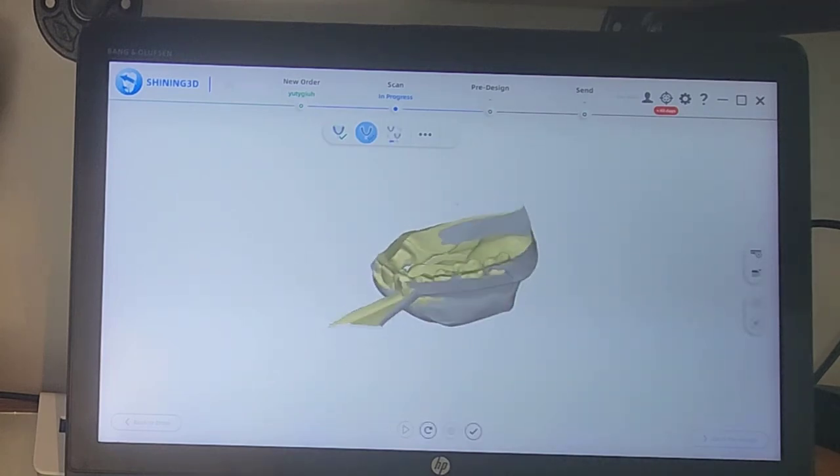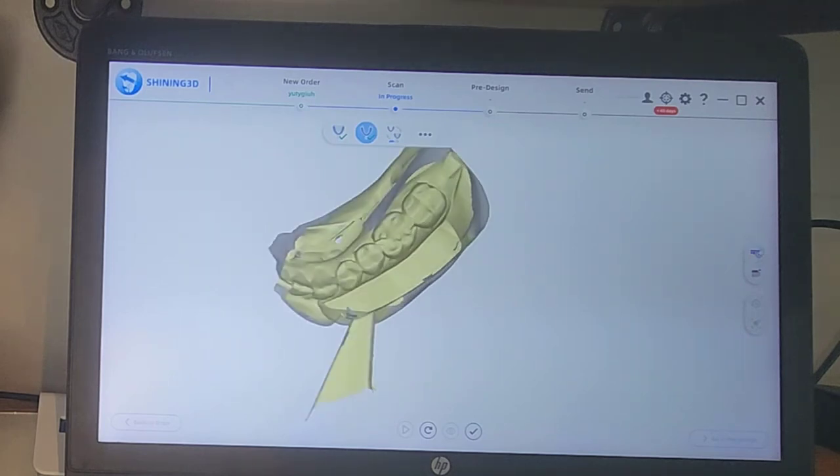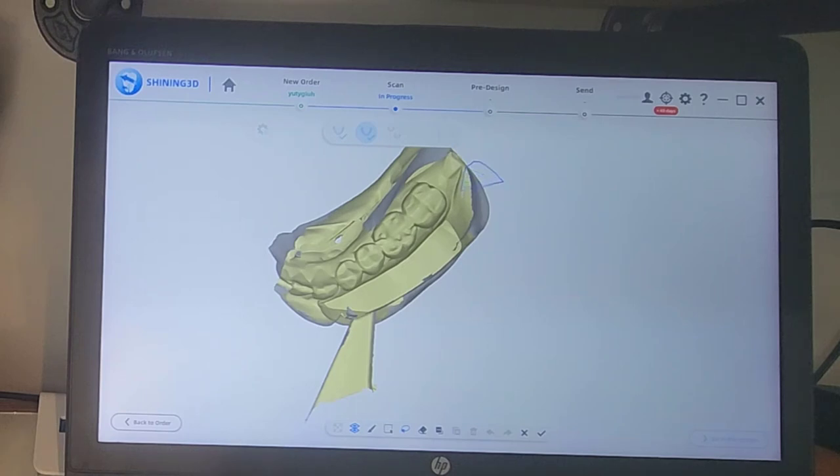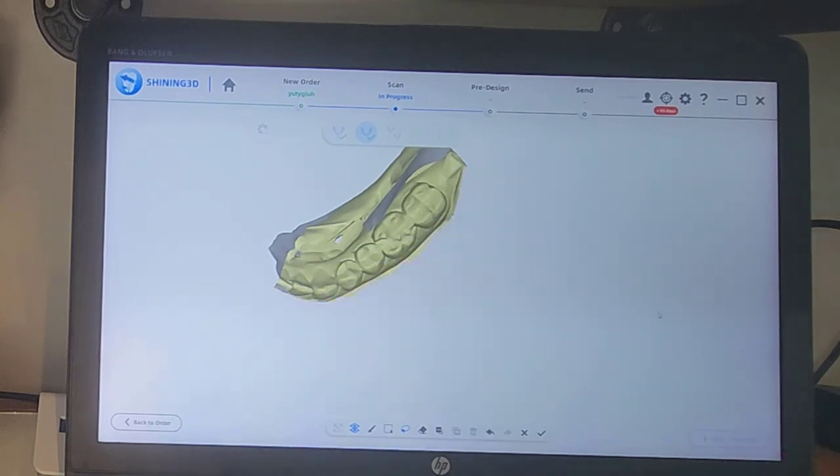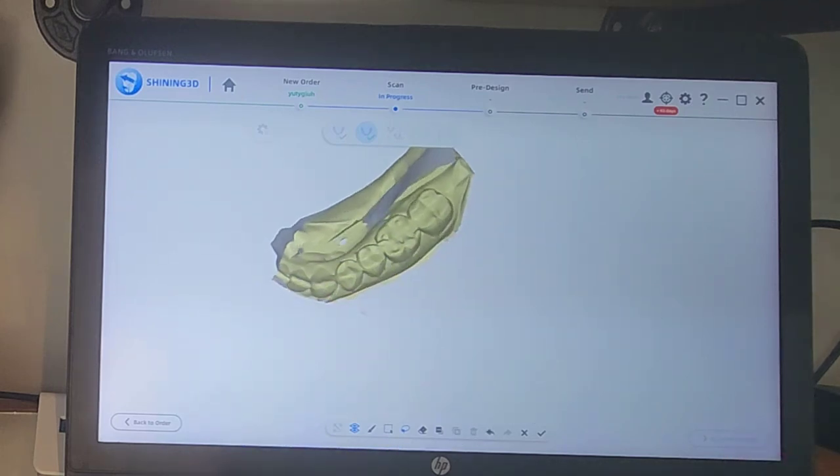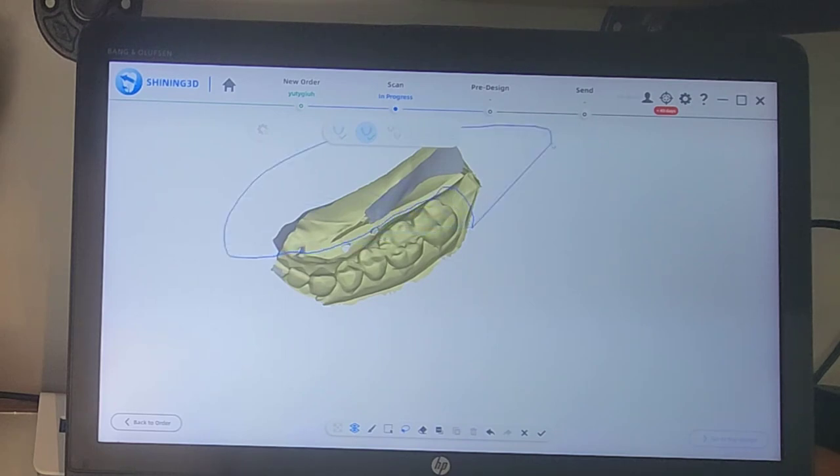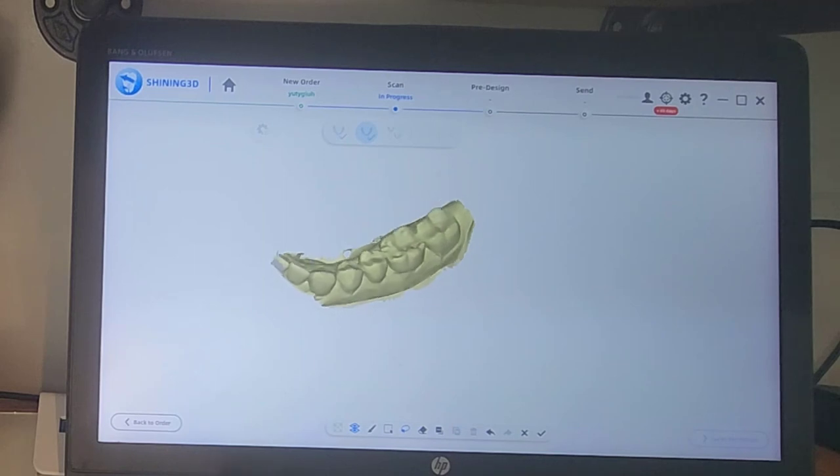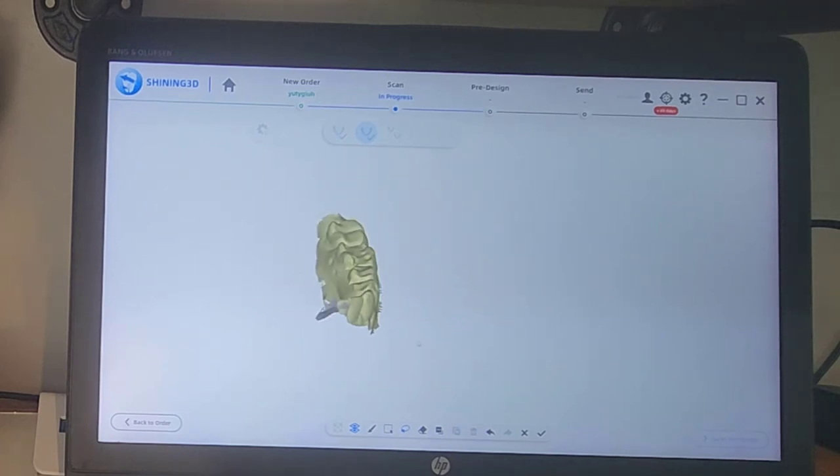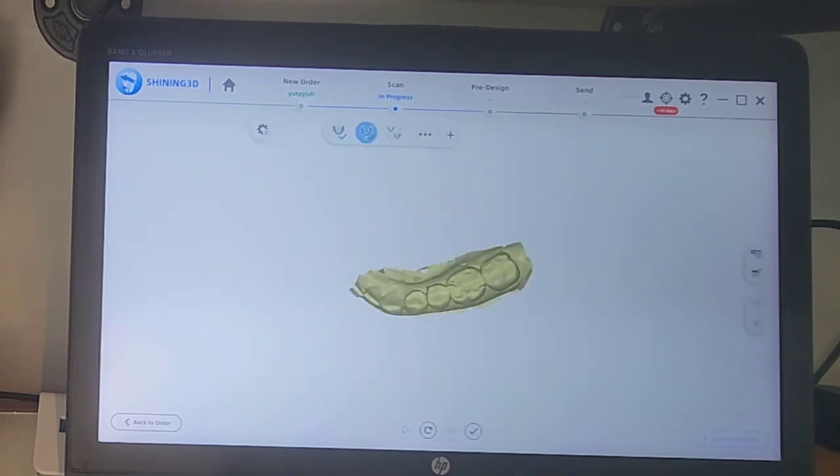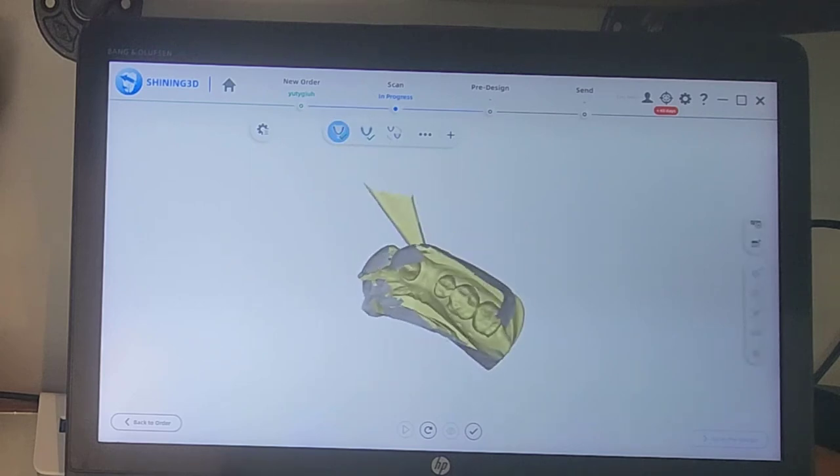And now we can do any data editing. So I like to trim my models up, so let's go to the edit tab, and I'm just going to circle these areas that I do not need. And we'll delete that. And then I'll look from the back. And we'll delete that. Okay, so there's my mandibular model. I'll okay it.